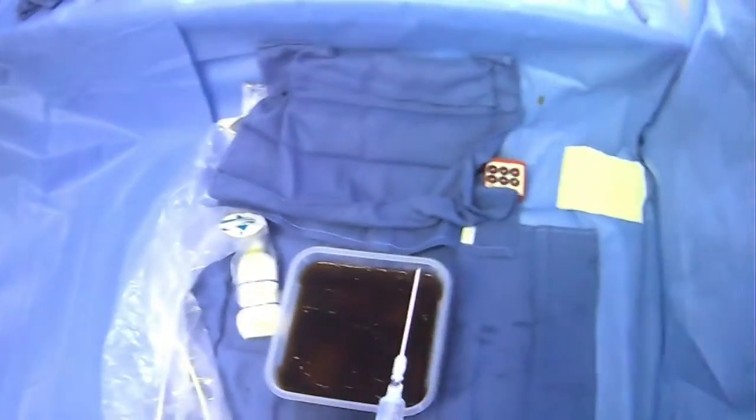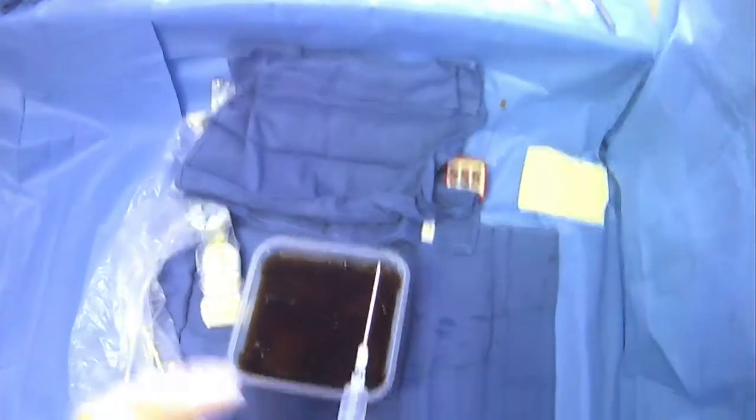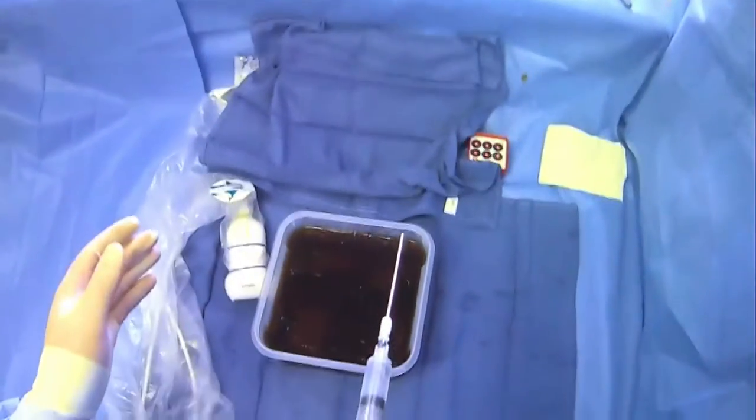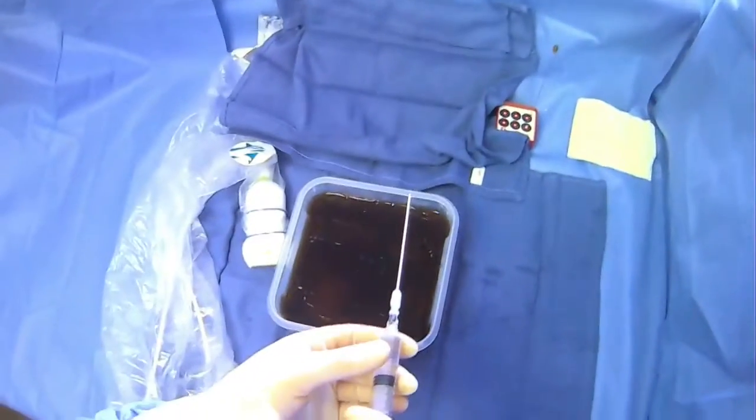Number one, you have to decide: are you going to use ultrasound in real time or not? For this particular video, we're going to go over hand positioning considerations when you're not using ultrasound. The advantage of ultrasound is that you can see where your needle is; however, the disadvantage is that you lose one of your hands and it's a bit harder to manage this apparatus.